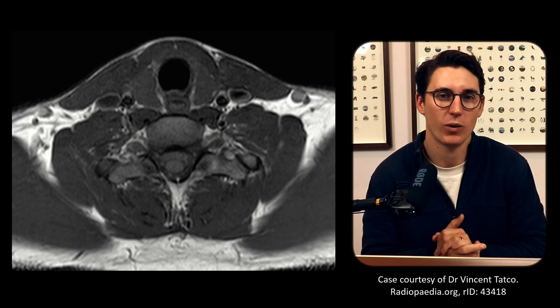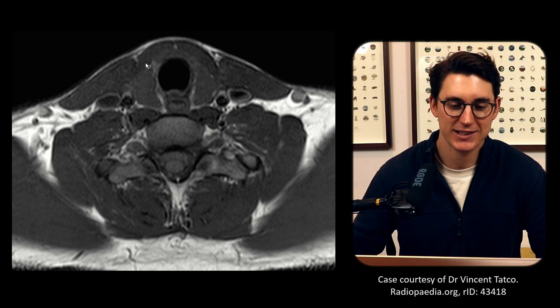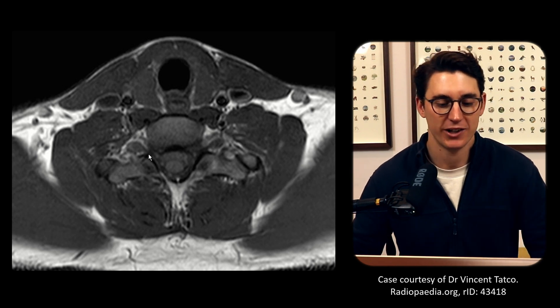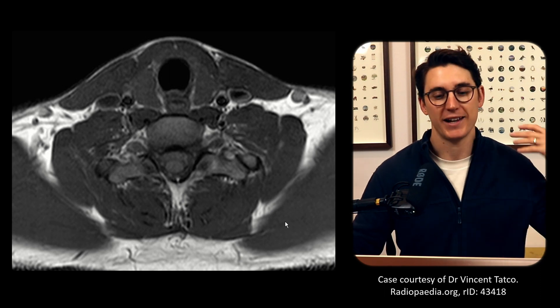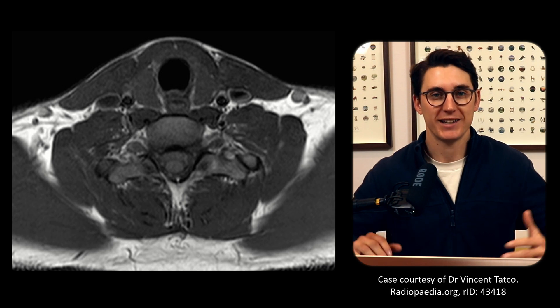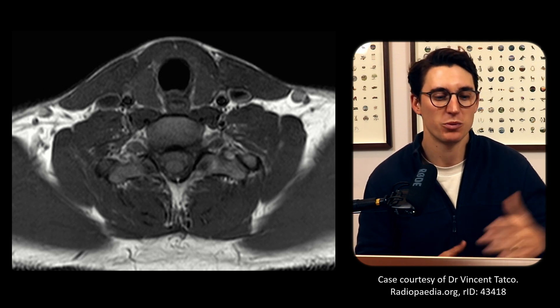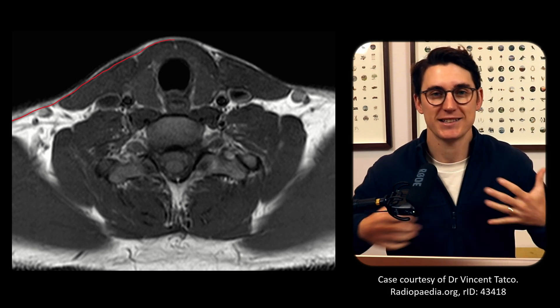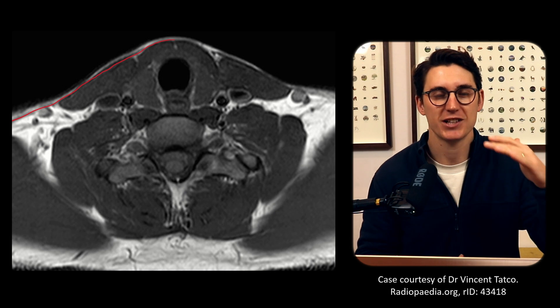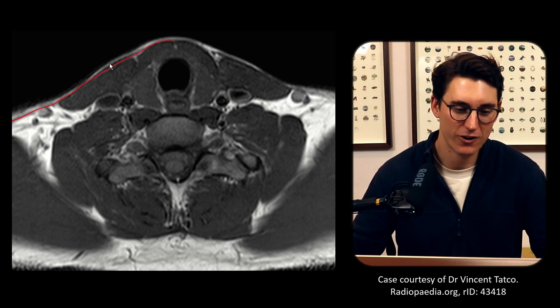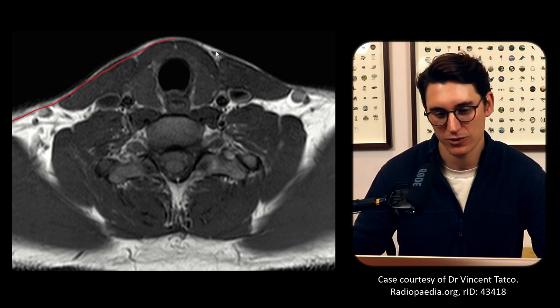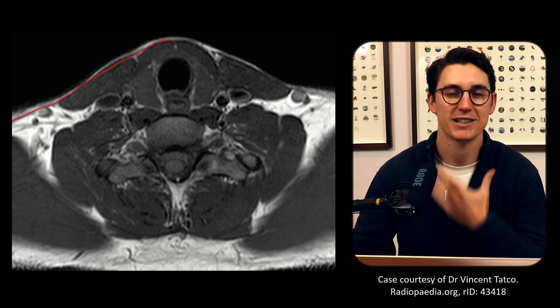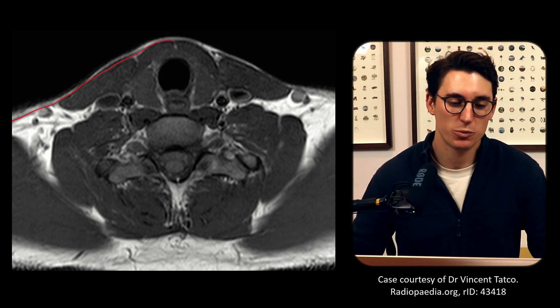Let's look at this axial T1 weighted slice of the neck and orientate ourselves. This is the anterior side of the patient, with our trachea lying anteriorly, the strap muscles and sternocleidomastoid muscles out anterior. We can see our vertebral column and trap muscles posteriorly. Now if we're going to identify the deep cervical fascia, it goes without saying there's probably a superficial cervical fascia. Our superficial fascia runs along this red line — it's the same superficial fascia found throughout the body, lying just underneath the subcutaneous tissue. We can see a thin muscle running on both sides: that's our platysma muscle, which runs external to our superficial cervical fascia.